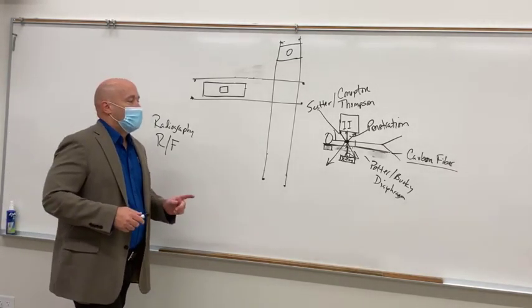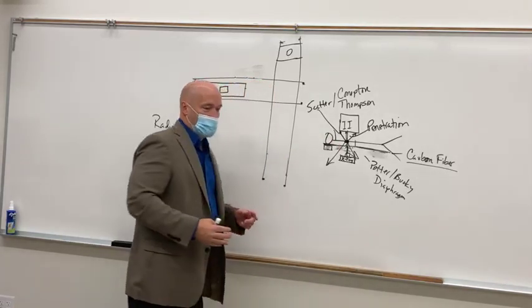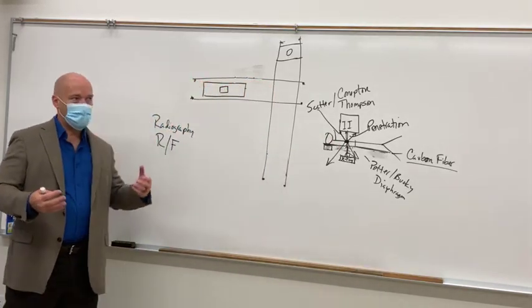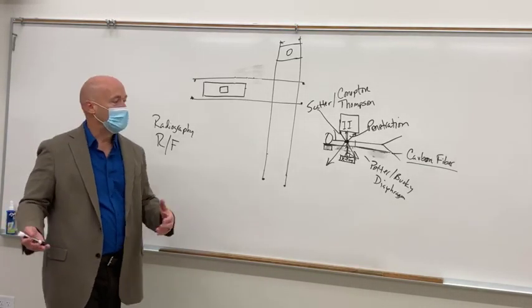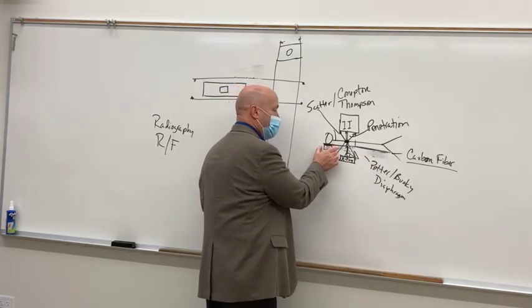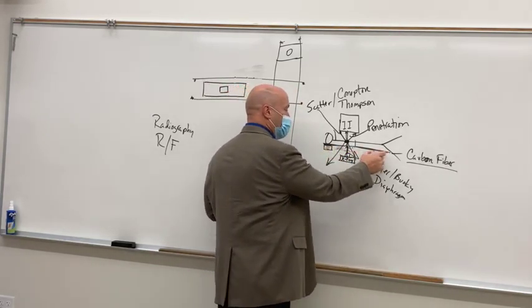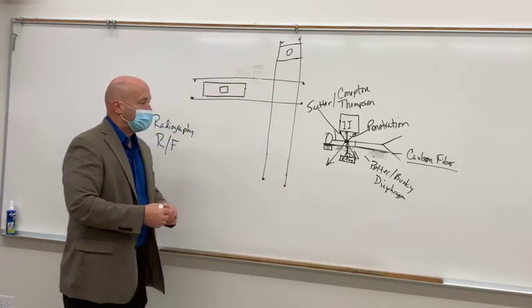So have you ever noticed that whenever you move the bucky, and you probably haven't because they've designed tables now to where it's pretty seamless, but whenever you move the bucky, obviously that bucky is taking up space, right? So if it travels up and down the table, it is taking up space.